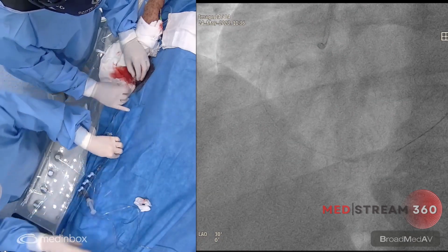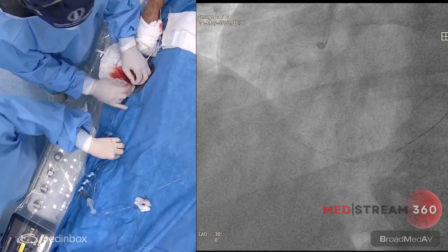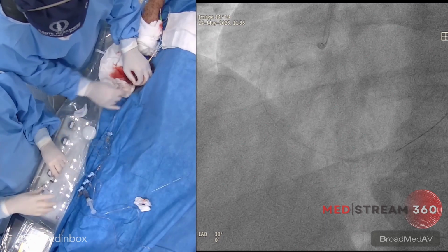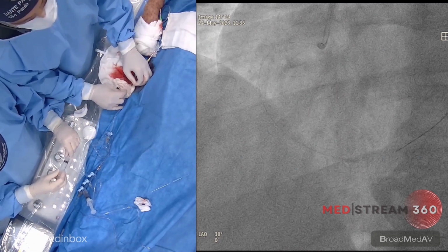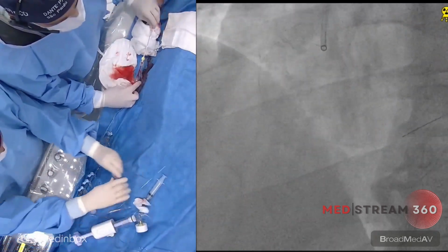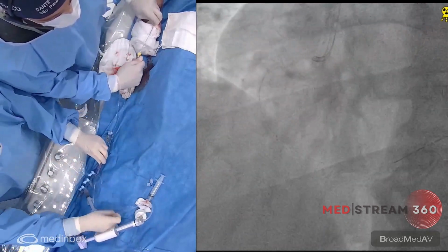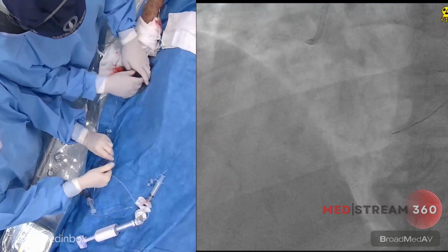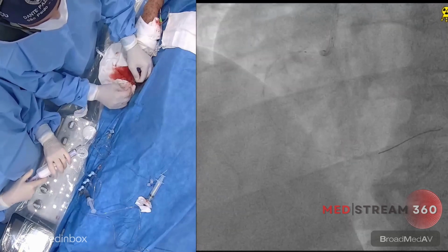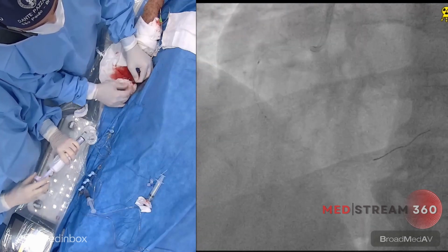How can we quantify with IVUS or even OCT? Is it possible to compare the two methods, IVUS and OCT, to quantify calcified lesions? Yes, there is a rule of 5 that has been validated as a predictor, and that includes up to 5 millimeters or more calcium in the circumferential measure, in depth or thickness more than 0.5, and also covering more than 50% of the circumferential plaque.